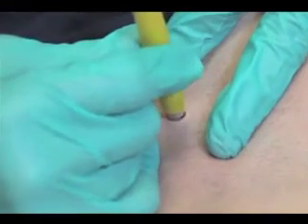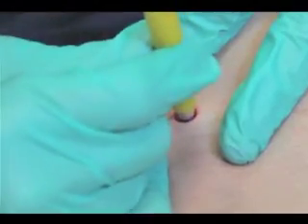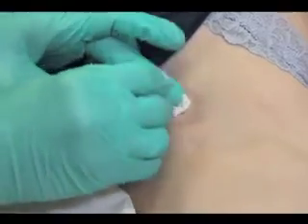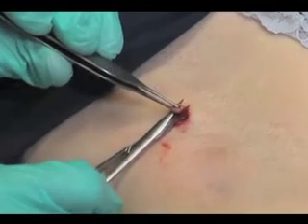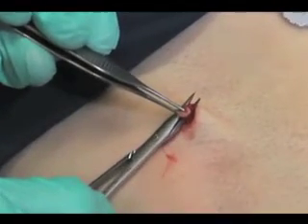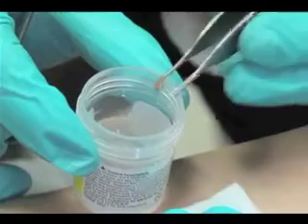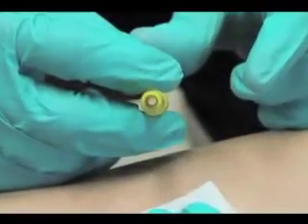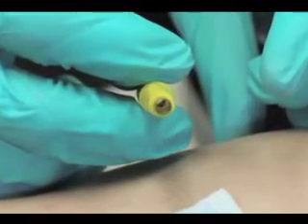Apply rotational and delicate downward pressure on the punch until you feel the give as it enters the fat layer. Withdraw the punch. At this point, bleeding may occur and require blotting with gauze. With toothed forceps, carefully grasp and lift the specimen, taking special care not to crush it. Use scissors to cut out the base of the specimen at the level of the fat. Place the specimen in a labeled bottle containing formalin. Check the punch instrument to be sure no tissue remains — a good rule of thumb is to be able to see through the entire hollow tube.